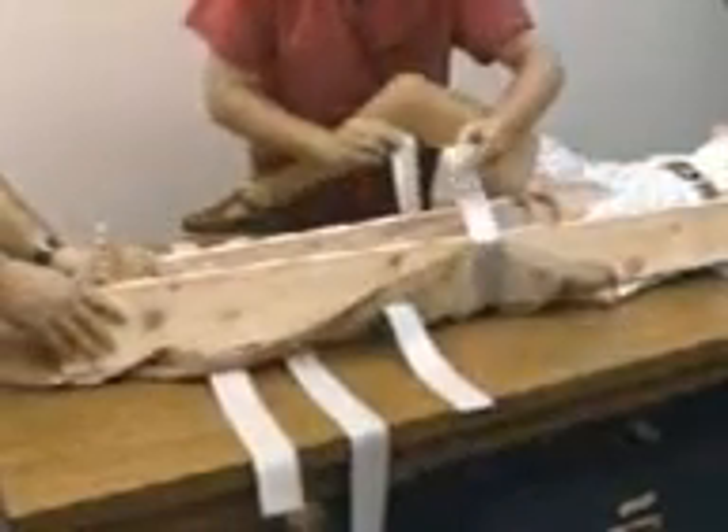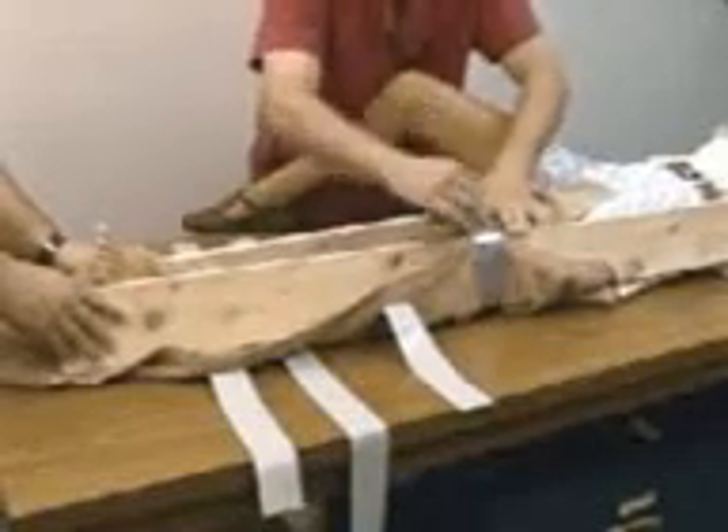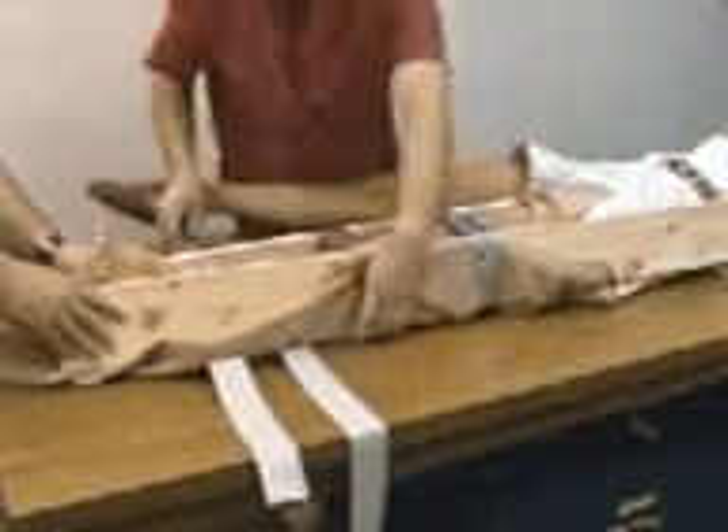The outer splint should extend from below the heel to the victim's armpit. The inner splint should extend from below the heel to the crotch. Secure the splint in place using cloth ties or tape.